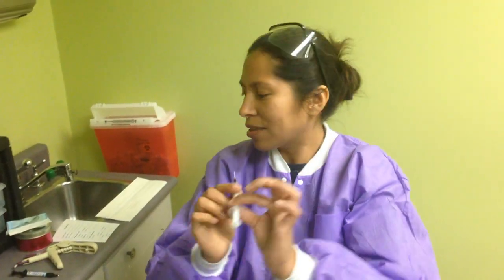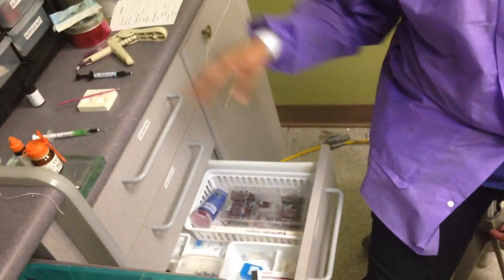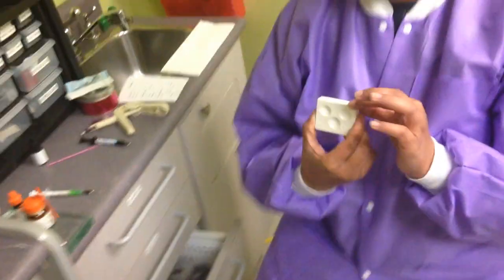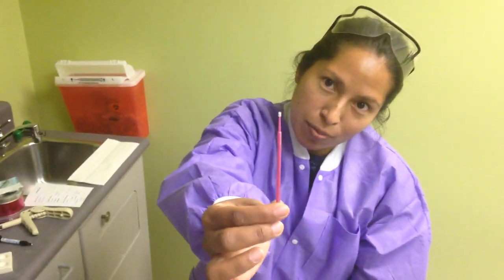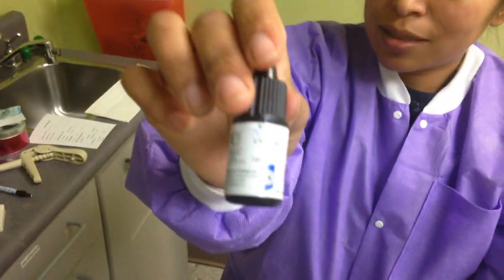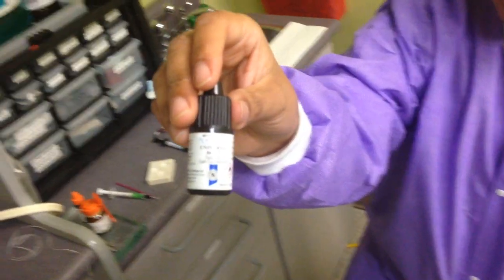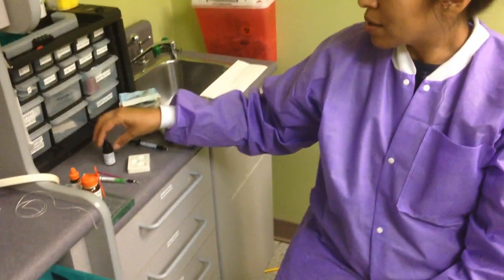You get out your etch. The tips are located in the restorative drawer — all these filling materials are located in the restorative drawer. You get out your dappen dish, your microbrush applicator to apply the bond, and you get out your bond. The kind of bond we have is universal bond, but any material that has bond written on it is usually for fillings — it's like the glue for the filling.